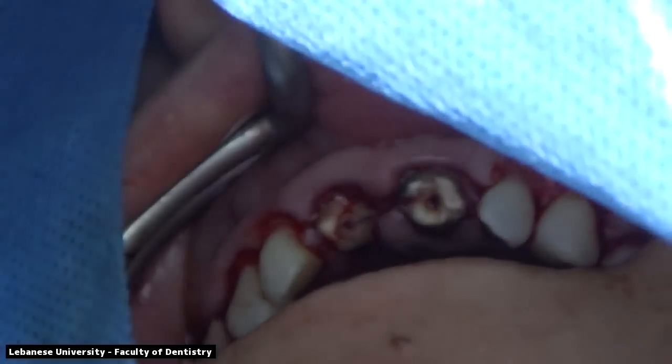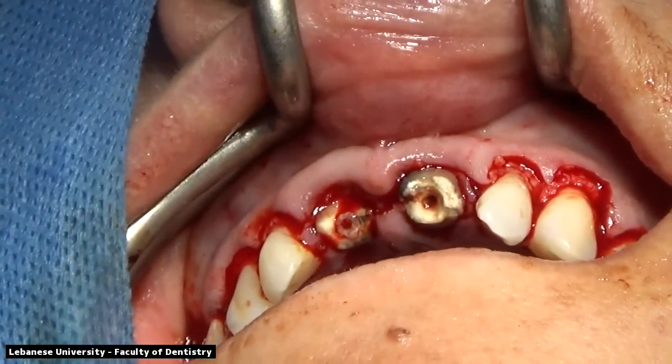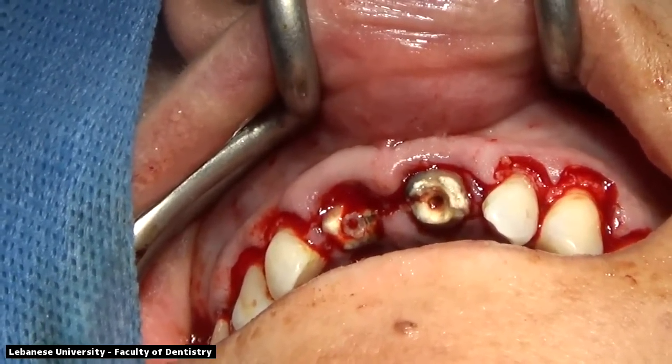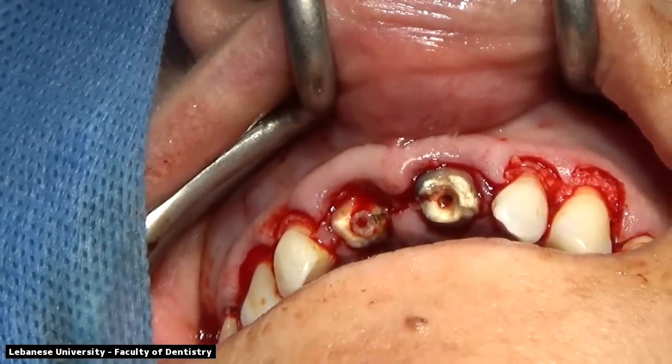We are doing the crown lengthening procedure prior to the implants, so that we do not keep the implants exposed to the oral cavity, so that once we place our implants, we're able to close the site and suture immediately. So the crown lengthening has to be done prior to the implants.